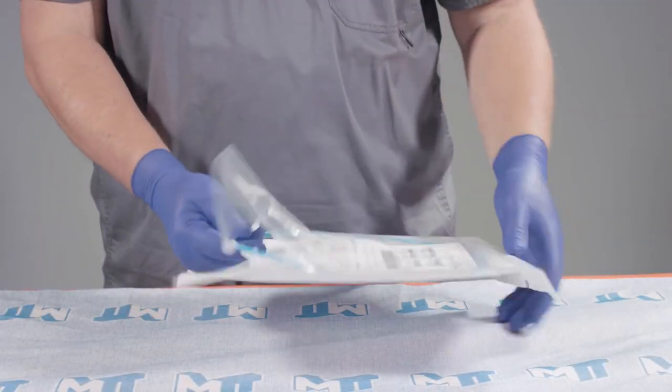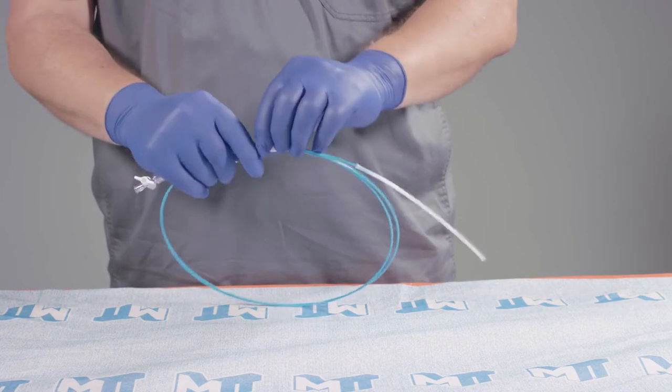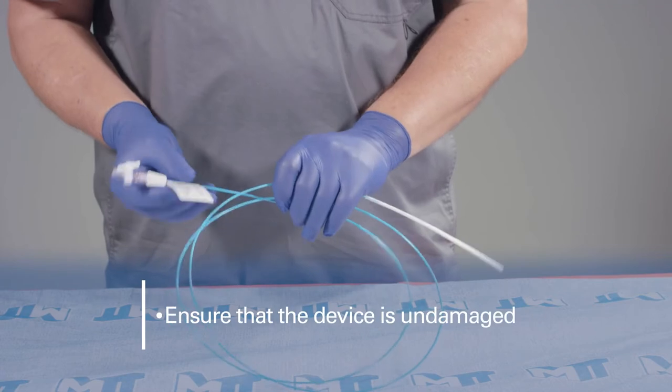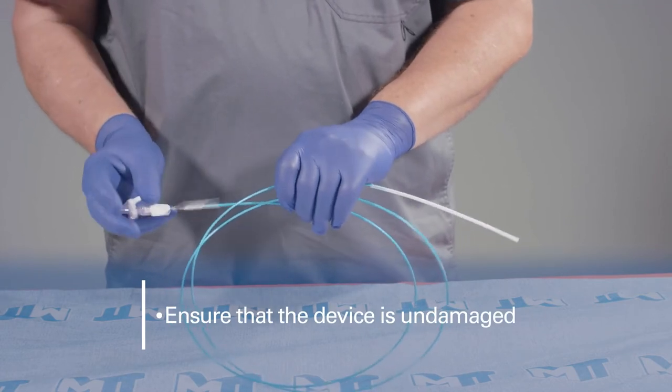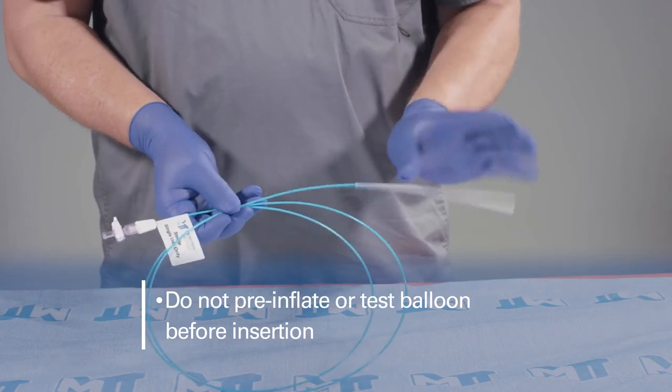Open the pouch and carefully remove the device from the packaging and uncoil. Prior to use, ensure that the device is undamaged. Don't pre-inflate the balloon or test it before insertion.